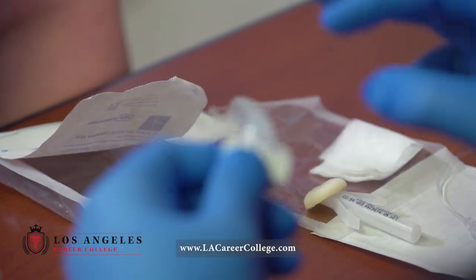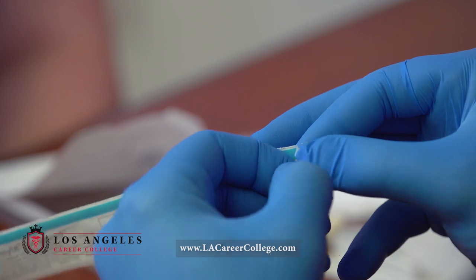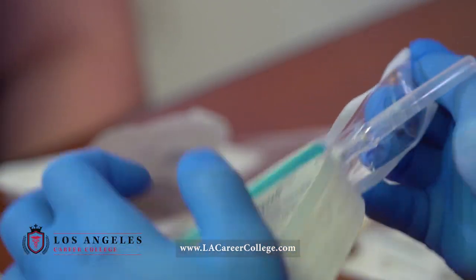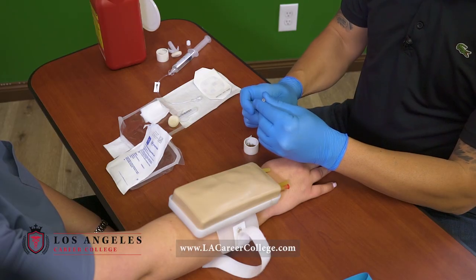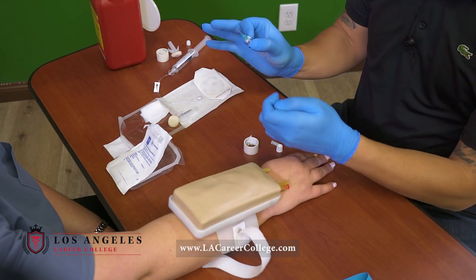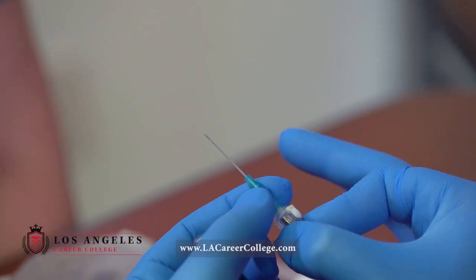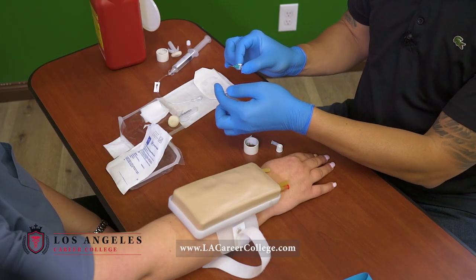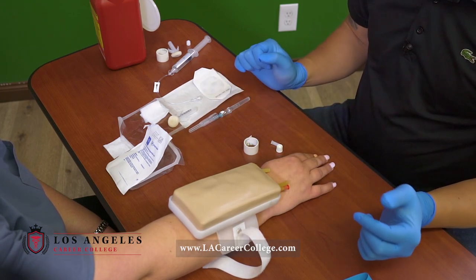I'll go ahead and take out my needle. One thing that you don't want to do is immediately expose the needle when you open. I'm gonna go ahead and open it and inspect the needle, make sure it's intact. Then I'll go ahead and place it here just like this.